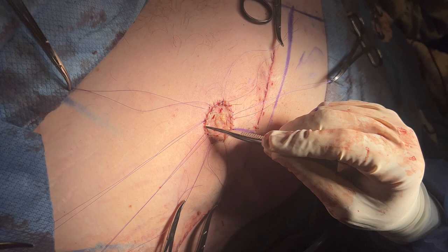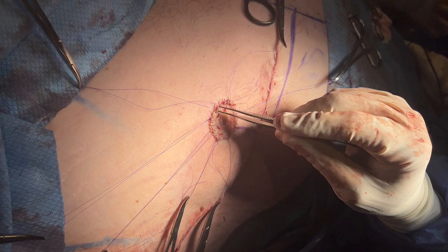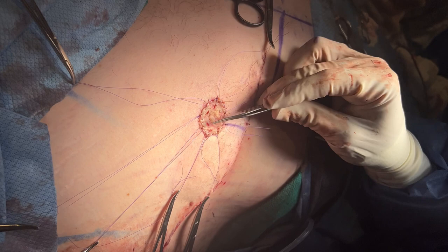We put on a couple of different sutures. One is a baseball suture that'll stay on longer and fall off by itself. The other suture we put on is a pressure suture.